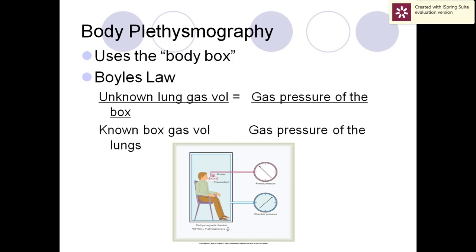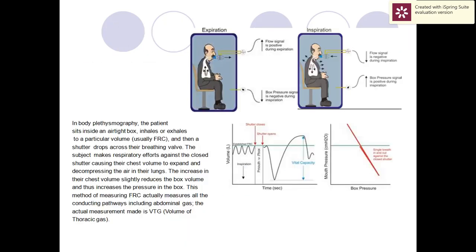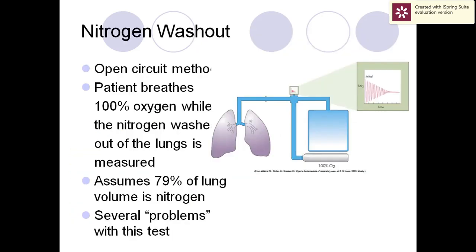How we can obtain, as we mentioned, in body box test or nitrogen washout or helium dilution test. طبعا هنا اللي هو Boyle's law اللي هو يعني equation for body plethysmography. طبعا المريض بيكون داخل الجهاز معروف الأحجام، وthrough specific equation in particular volume معروف اللي هو functional residual capacity, and can be also giving us the accurate measurement of residual volume and all the other volume اللي بتهمنا total lung capacity residual volume.